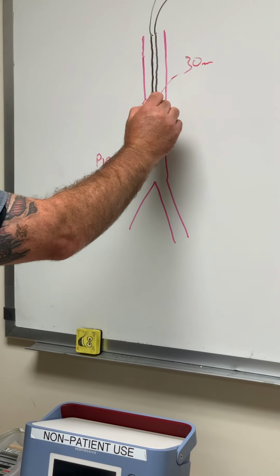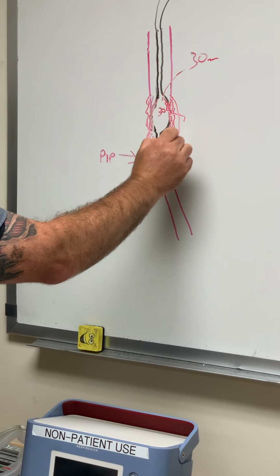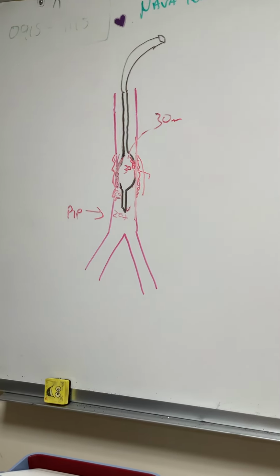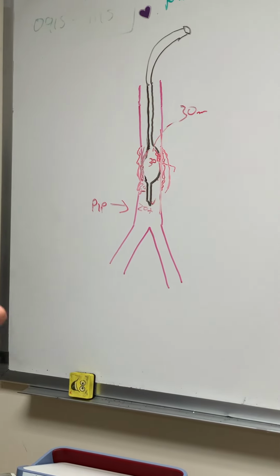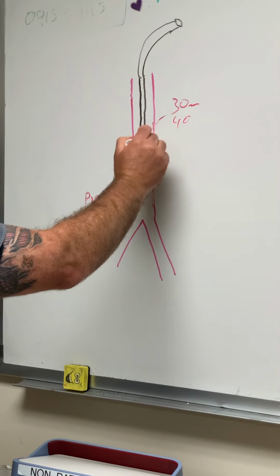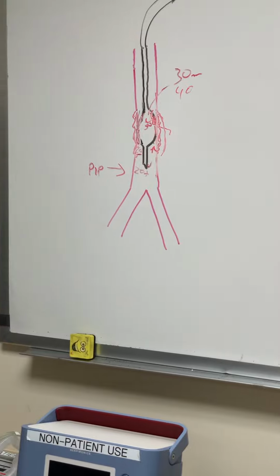So that cuff basically would push that floppy tissue, the tracheal area right here, and it would just push it away. So instead of being a rigid resistance to that cuff and holding its place, the malacia area, which happened to be right in the cuff area, would give as you inflate it, and the leak would still be there because it wouldn't resist that pressure. So you would need more and more pressure in the cuff to get that seal of 20 or below. And that's one side effect of having tracheomalacia with cuffs and how we manipulate them.